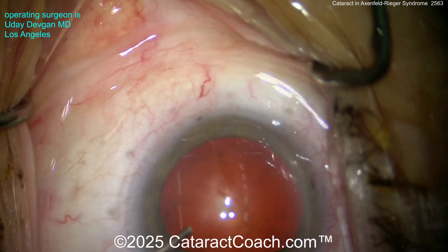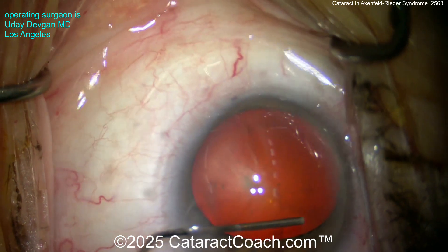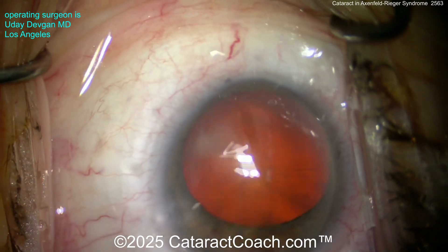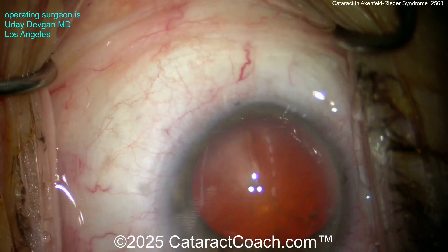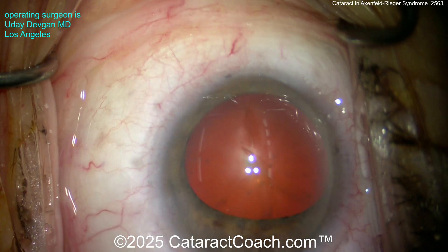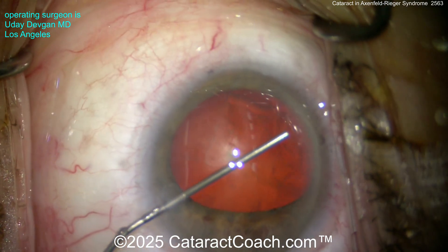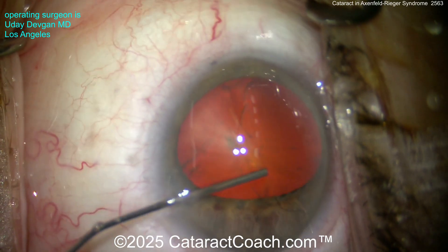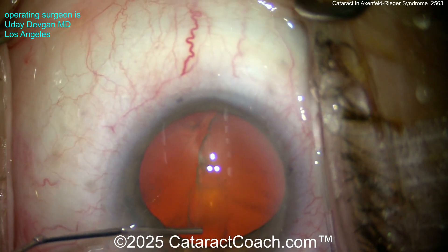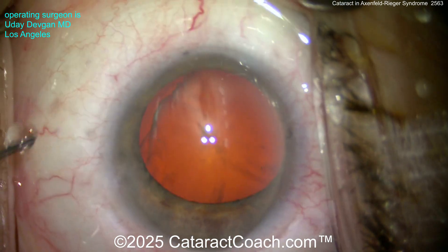You can see that temporal aspect — we'll make our incision there, the furthest from the visual axis. Putting in some anesthetic here to see if I get more dilation. This patient has an asymmetric dilation: nasally the patient is dilated normally, superior and inferior as well, but temporally not as much. Now putting in our viscoelastic and we're just trying to see if there is lens stability — this patient could have abnormalities of zonular support.